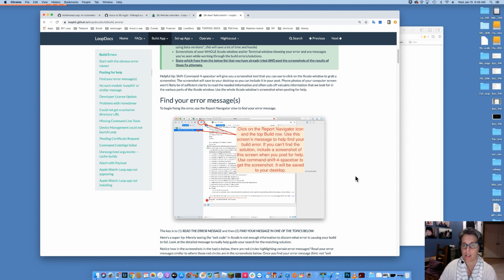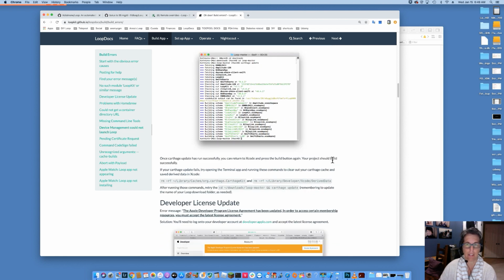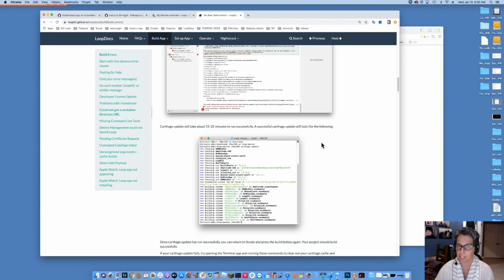And then post that on Zulip chat in the build issues channel, or you can post it in Loop group, either one. Just make sure you include the screenshots of the report navigator as well as the terminal app if you tried other solutions like this one. That's also useful. Just as a general step, if that had failed, oftentimes, regardless of what the message is, I go ahead and try cleaning the Carthage cache and derived data. I do this step often just as another good measure, good housekeeping. And then I try building again. But this should help. All of the build errors can be fixed up here, and I hope that helps.